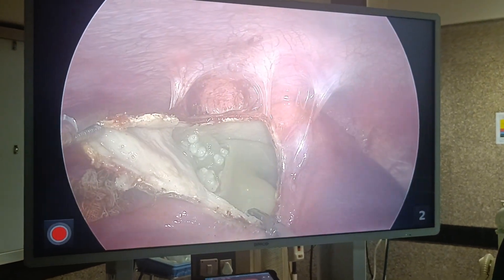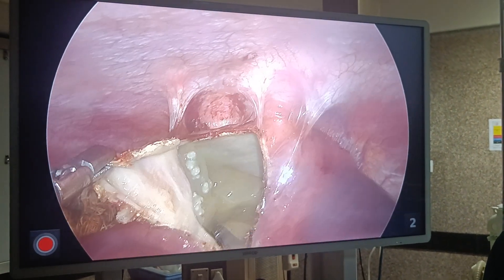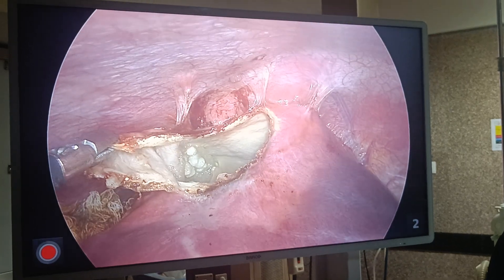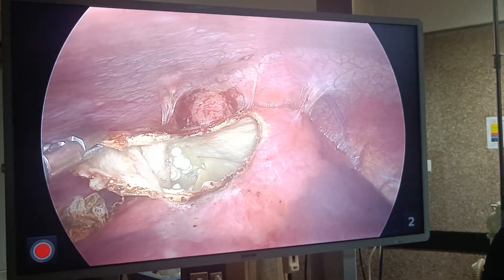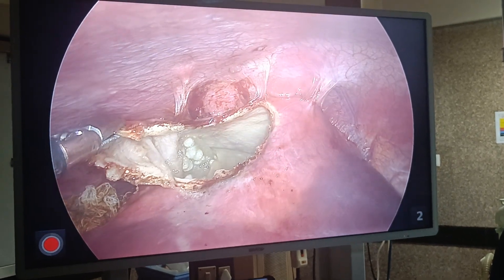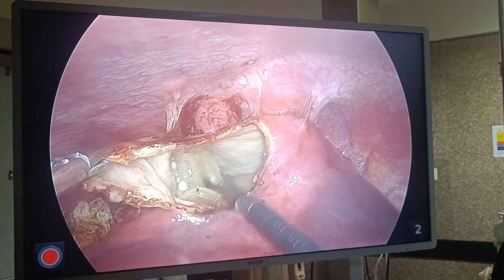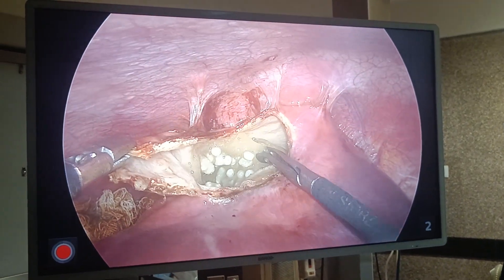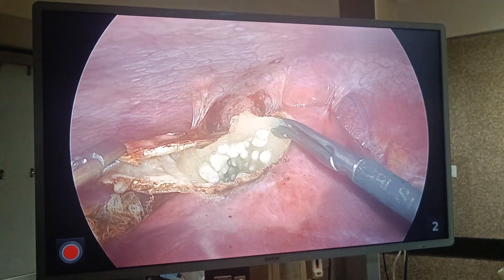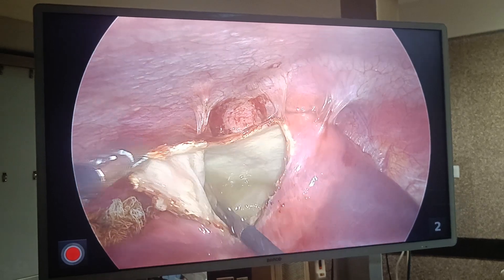Can you see now — this is the large cyst and this is all the hydatid membrane. This is very interesting for junior surgeons. Can you see a very beautiful typical picture of hydatid sand? This is the hydatid sand and this is the hydatid wall.